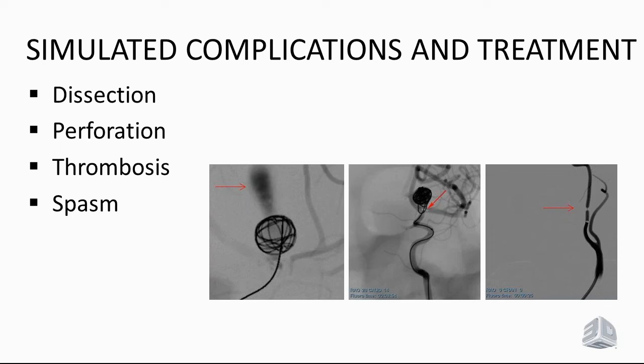And to their credit, 3D Systems / Symbionix has built in a lot of nuance. It's just not all about pushing the catheter. It's about watching the blood pressure, watching the heart rate, and having to be able to deal with these kinds of problems should they arise.